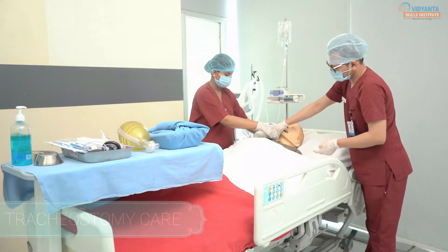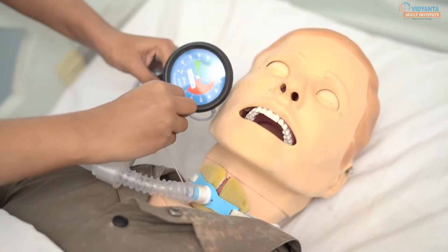In this video, a nurse will understand the various aspects of tracheostomy: steps of procedure, equipment required, after care, and most importantly what to do when things go wrong — in other words, common clinical errors.